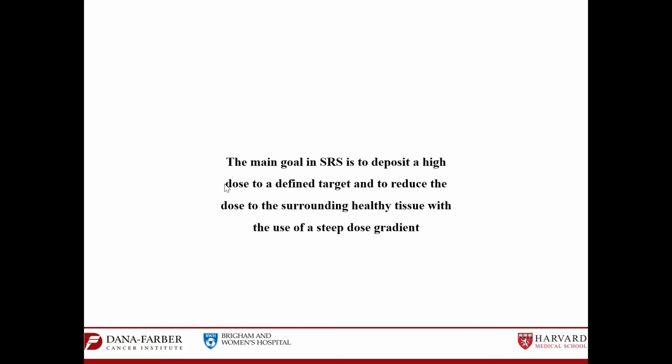In all the courses where you're discussing stereotactic radiation, at any site in the body, the main goal is to deposit a high dose on a defined target lesion and to reduce the dose to the surrounding tissue with the use of a steep dose gradient. That's the main goal of doing the focused radiation, which is called stereotactic.